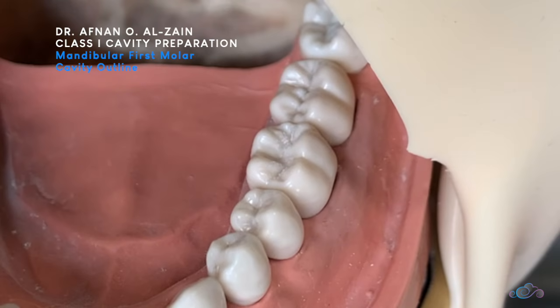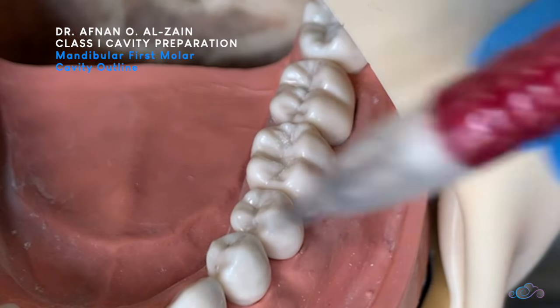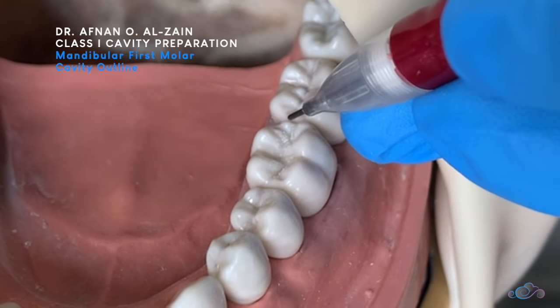Hello everyone. In this video I will show you how to do the class 1 cavity preparation in tooth number 6.